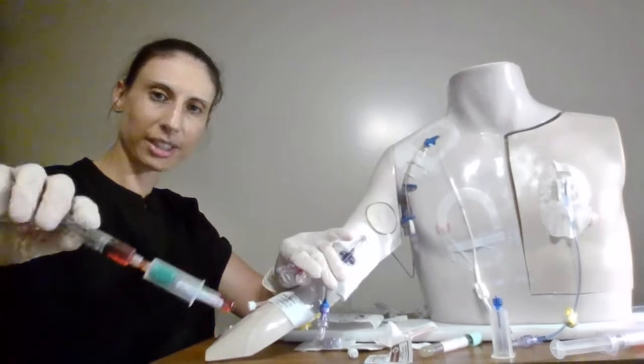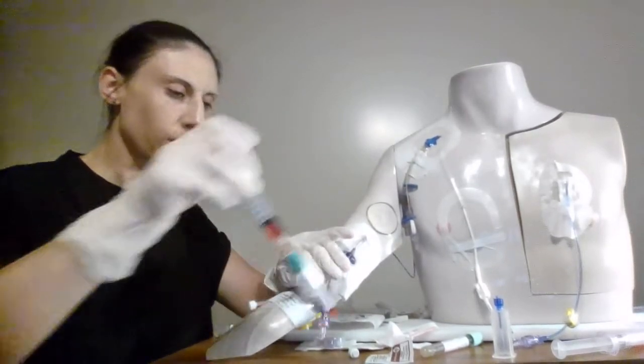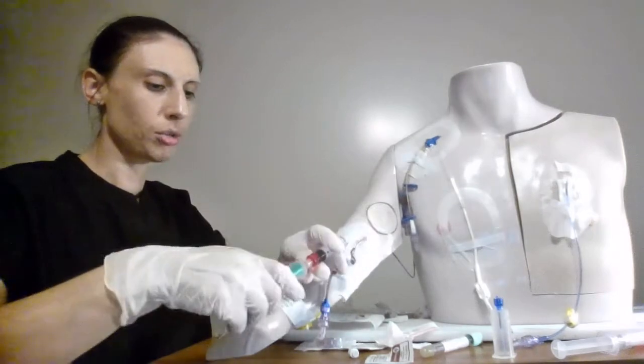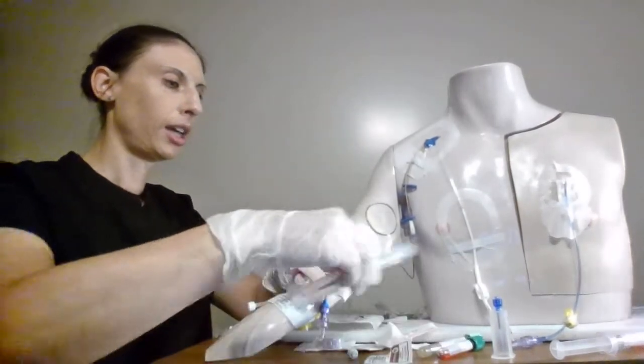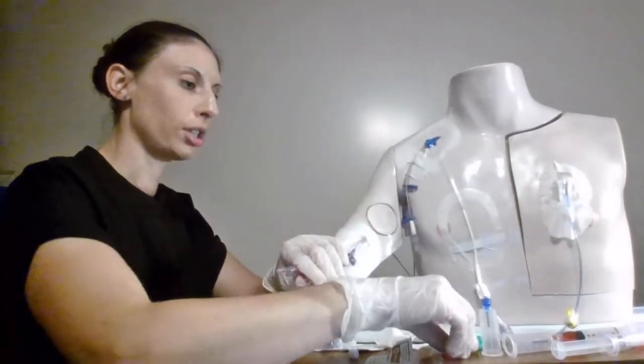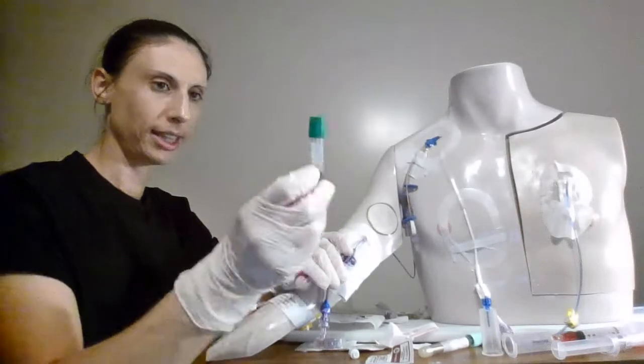And it would keep filling until it's got the amount that it needs. Often there's lines on the tubes as well which will tell you where to stop. I would also check my inversion chart to make sure I invert this however many times I need. And label it appropriately.